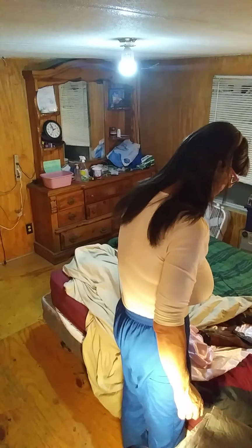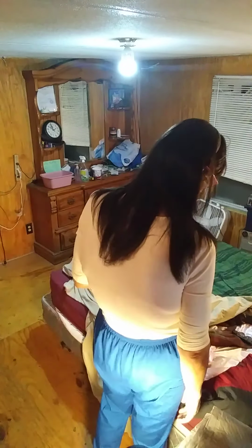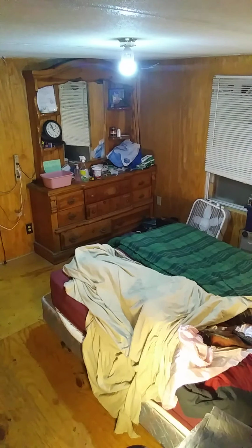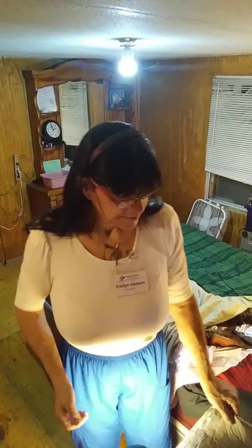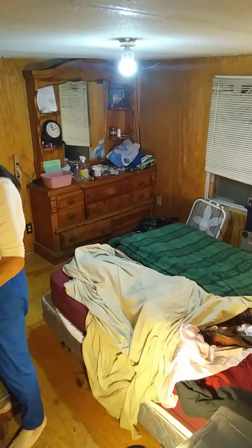What I'm going to do is we're going to do catheter care today, okay? I'm going to have to wash your catheter so you don't get a bacterial infection or UTI, urinary tract infection. Okay, first I'm going to wash my hands and gather some supplies, okay? So I wash my hands. First I'm going to get a linen protector to put on my overbed table to create a sterile barrier.